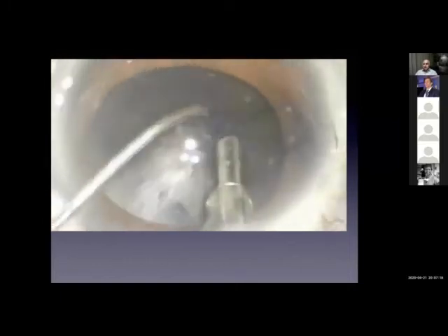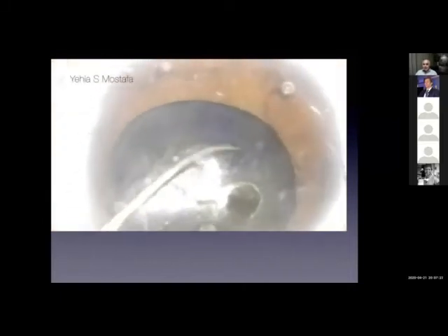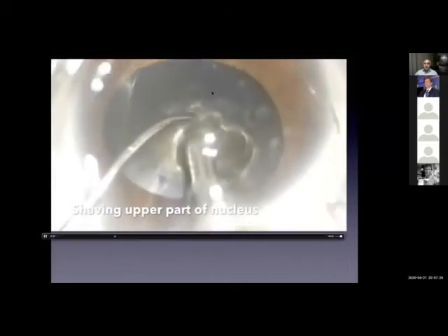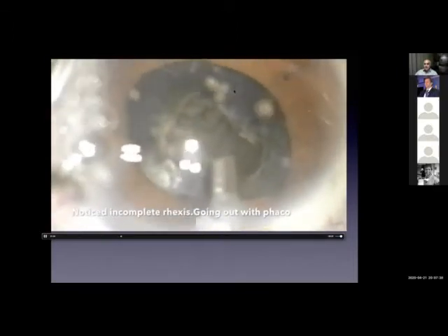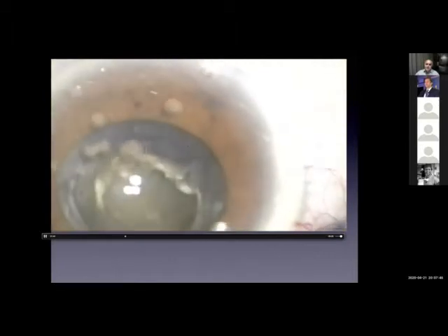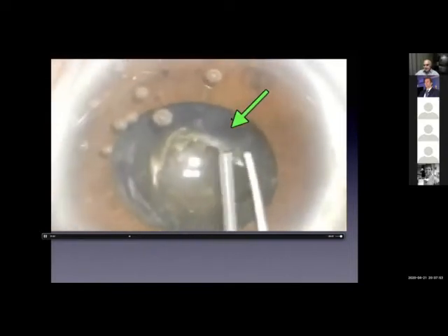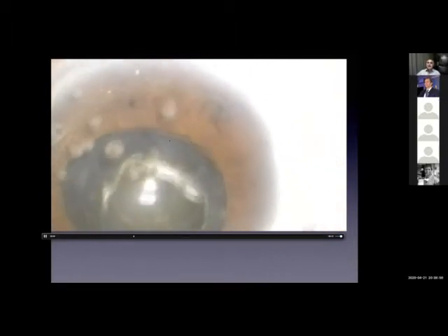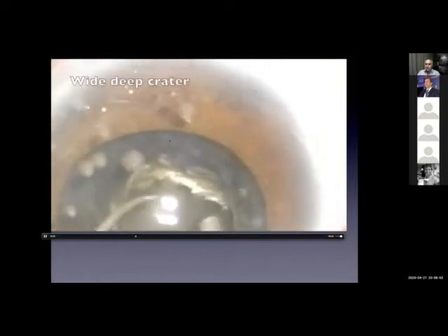No hydrodissection. I'm exposing the tip very much, and this is very important. When I started to do the double nucleus concept, trying to shave the upper part and making a large wide groove — I realized at this moment that I did not complete the rhexis because the visualization was not perfect, even with the stain, because it's a black cataract. So I stopped, and you can see the capsular edge. I re-grasped and continued my rhexis. If I miss seeing this, I will get into serious problems later on.